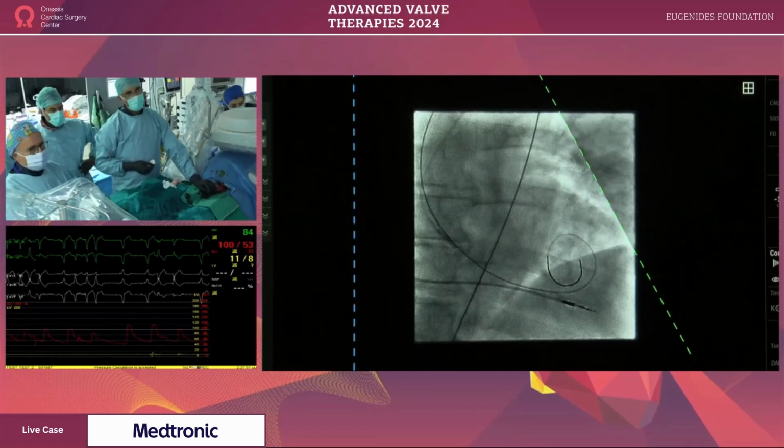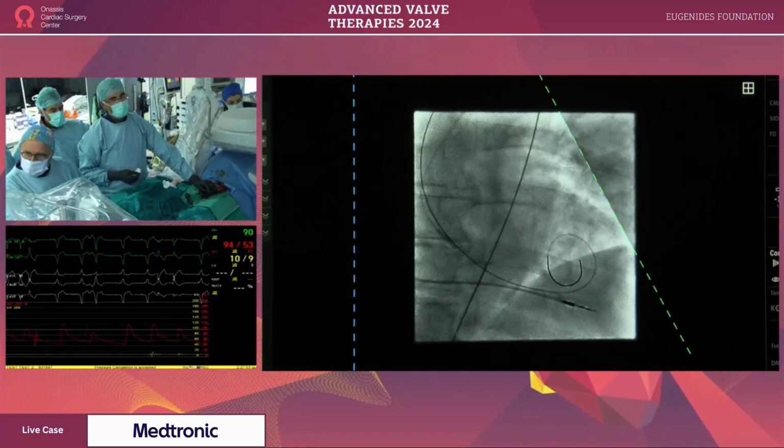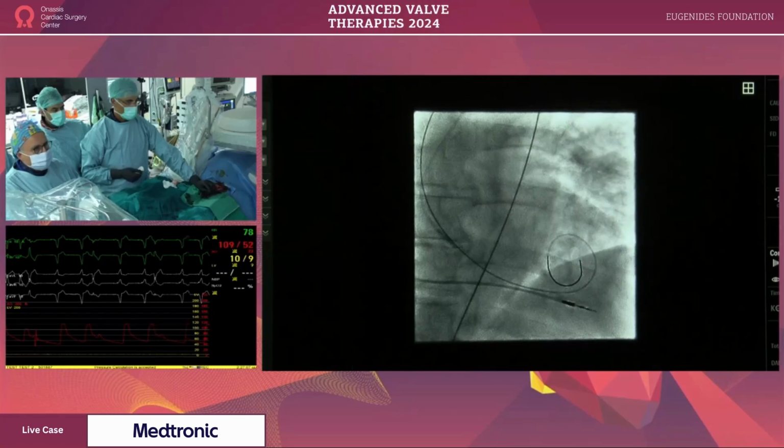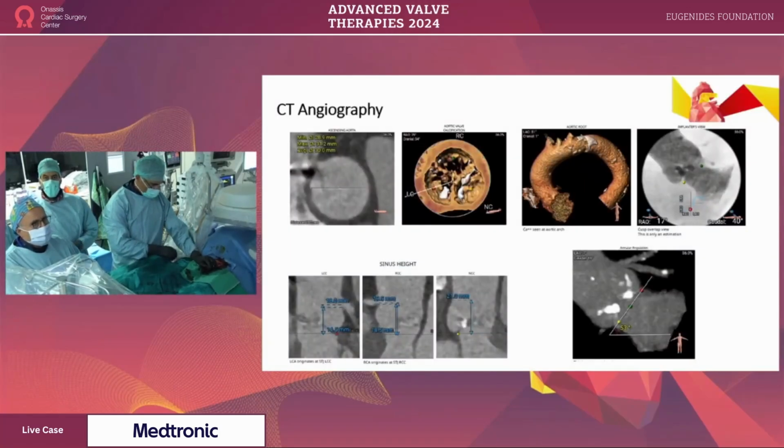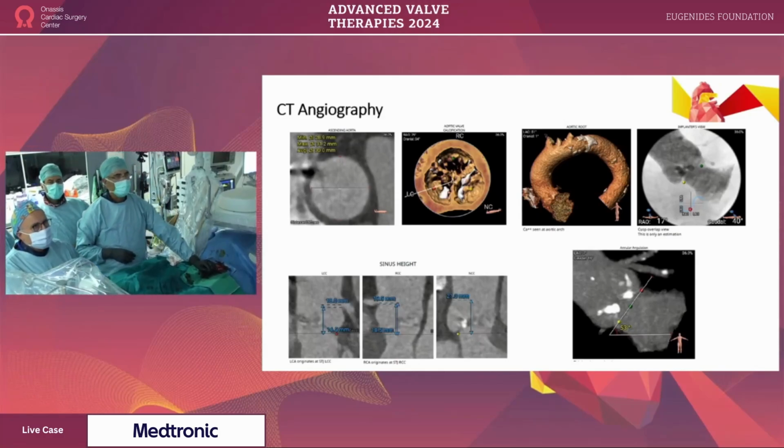So I think it's very important that the ultrasound, when we change our practices, I think it's practice changing actually, despite there being many very experienced operators out there who are reluctant to change their practice, but I suggest that this is very important.